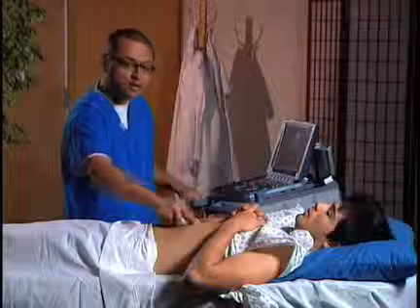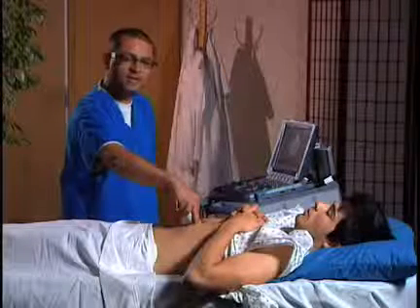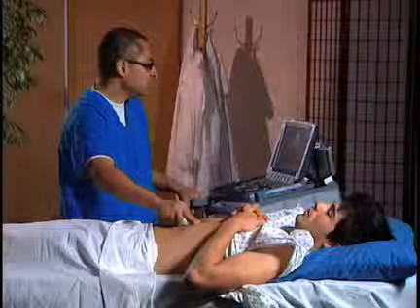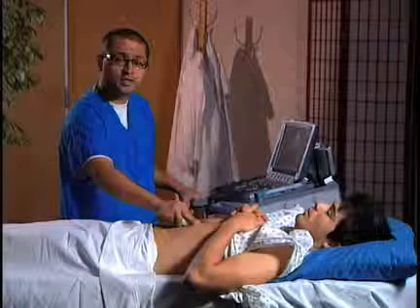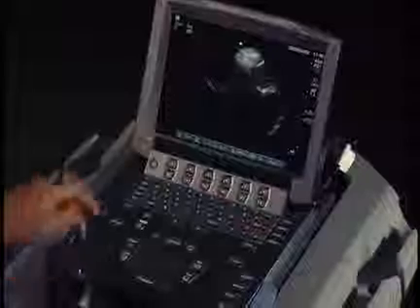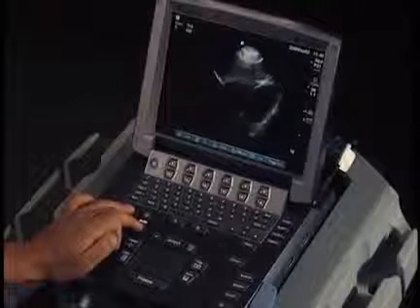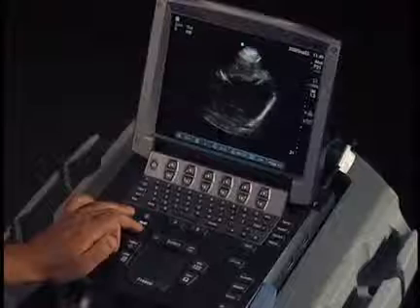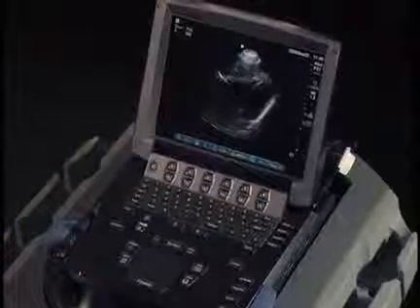A common mistake is to go too inferior into the abdomen, so you want to aim deep into the chest. When you're in this location, you're also going to need to increase your depth. I'm going to use my depth key right here and increase it so I can see the full heart in view. Now you can see we're at 21 centimeters.